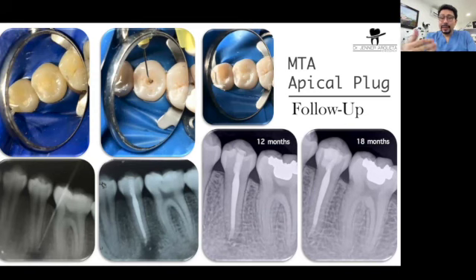But nowadays, if I have to do a similar treatment, I will finish that in an hour and a half, maybe, or maybe in 1 hour, feeling relaxed. Because I have a good visibility, I can be relaxed, I can have a better understanding of my clinical working area, and the microscope for sure will help.